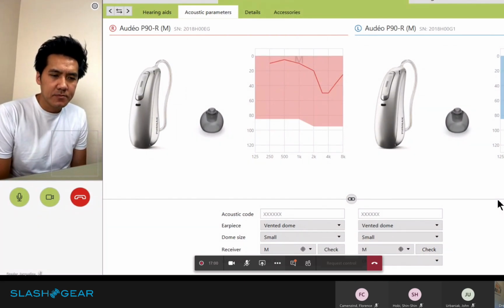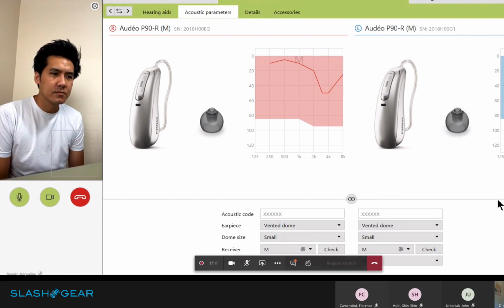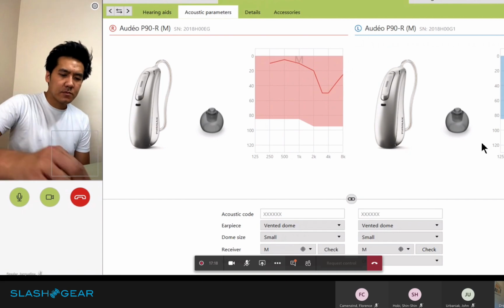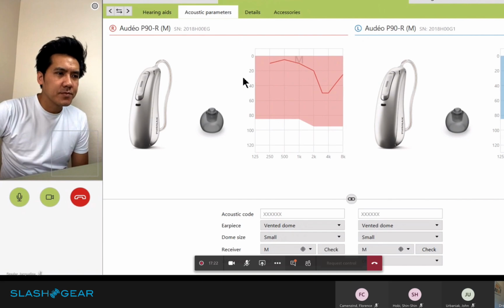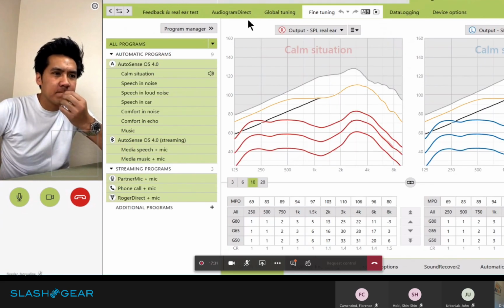Yeah. So it's really making sure we have that conversation with the client, since we offer different options and a broad portfolio of earpieces or custom hearing aids, making sure it fits the needs and the comfort of that client. So this is where we have the starting point and making sure this information is accurate. And then the next step I would do is make sure this information matches what you are wearing in the ear. Okay. So then I would continue and go into my fitting.